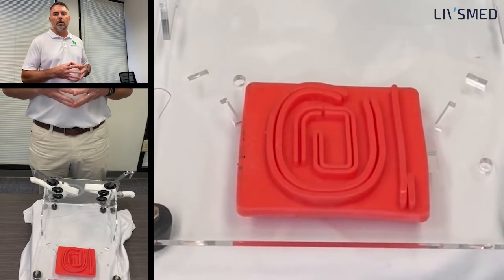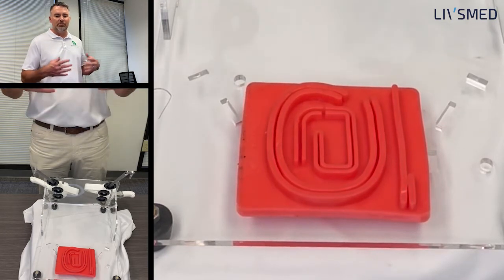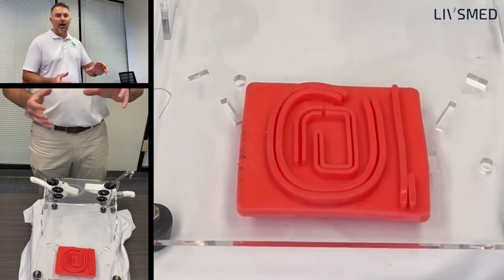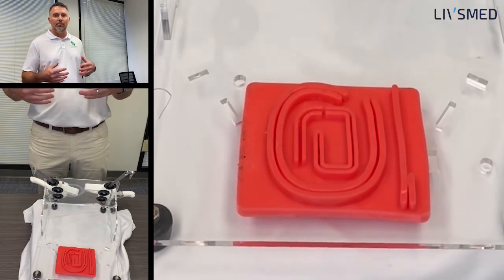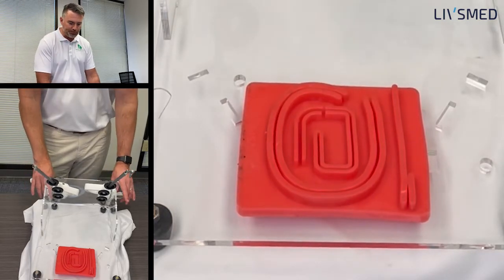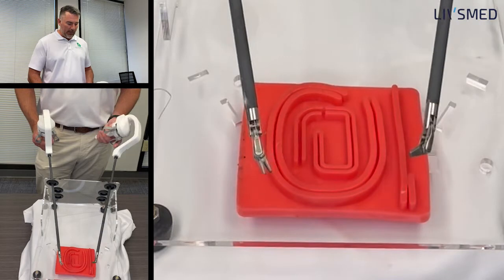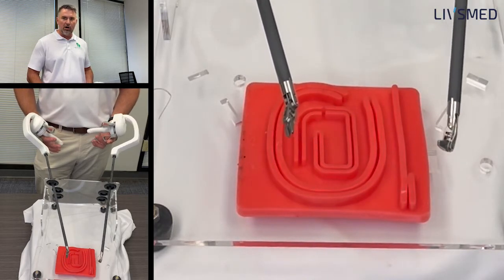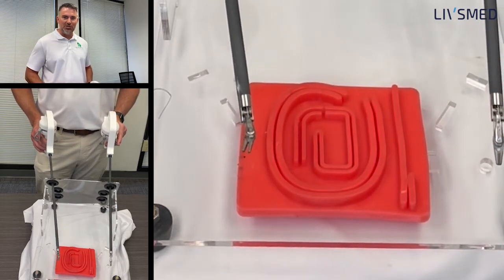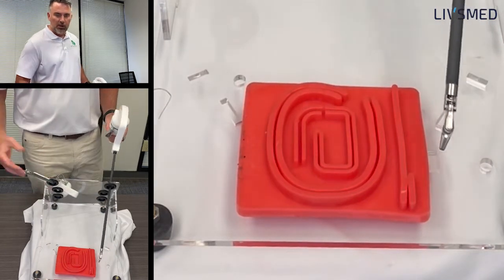The first thing I want to start talking about is really just how to get started as you're moving into suturing on the simulator — just getting those instruments in and out and figuring out how you're going to go about doing this. I happen to be using the types of needle drivers that are not locking, and sometimes that's a little bit challenging as you're getting started to get these into the simulator trocars. So just make it easy on yourself and start them off in place.